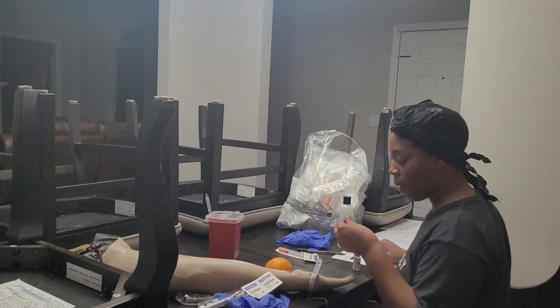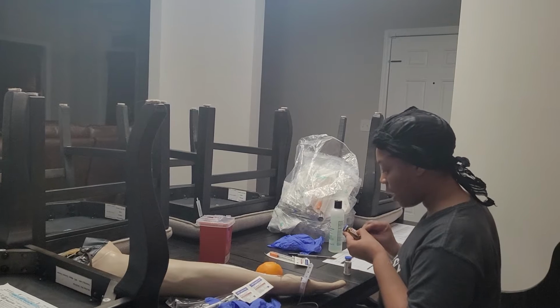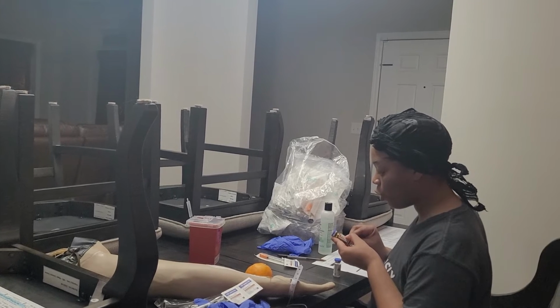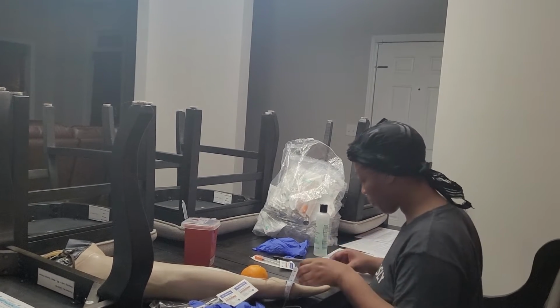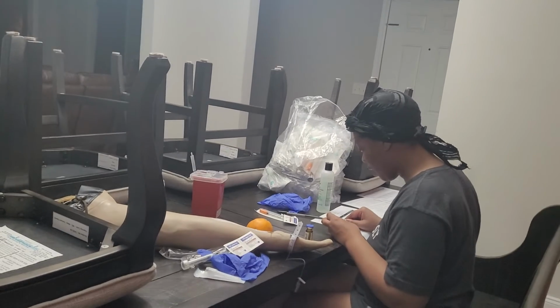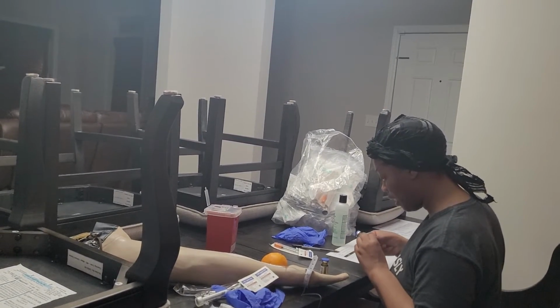So I'm pulling out my medication. This is furosemide, 10 milligrams per 1 ml. So I'm going to give 2 mLs of the furosemide. And I have the Lispro, 10 units right now. And this is insulin Lispro.